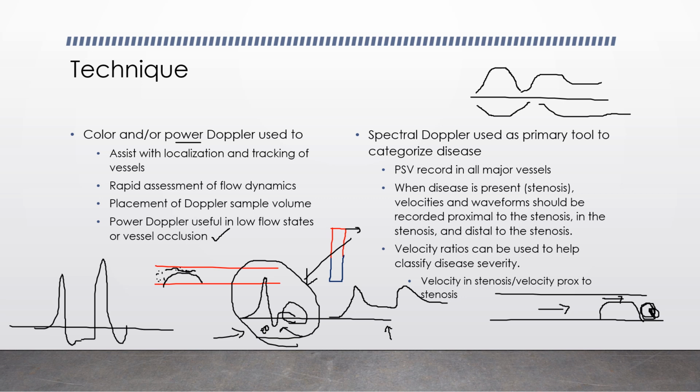Okay. Now, once that blood gets out of turbulence and gets going forward motion again, what you'll often see is that a lot of the velocity that our blood coming into that stenosis has is lost. And so what you'll end up seeing is there's not as much blood distal to the stenosis as required by the tissue bed it's feeding, and so you can see it become much lower velocity, something like that.